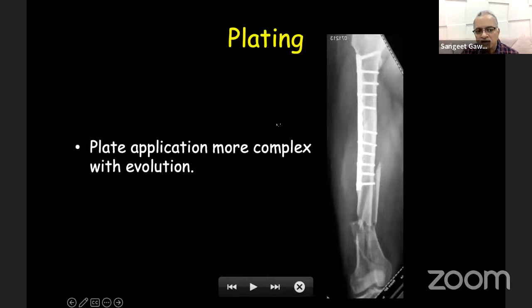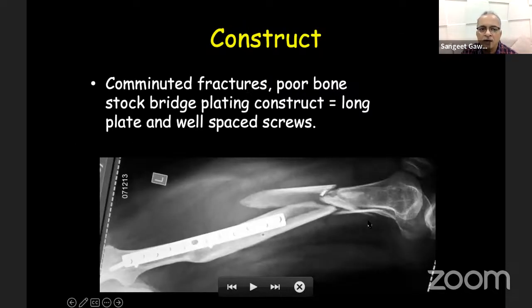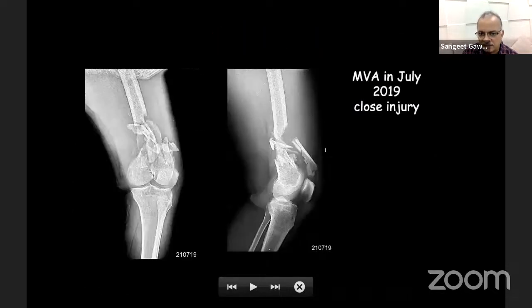Or if you have a complex fracture where there is an extensive comminution, there is an intra-articular extension, you have to mix the principle of neutralization. That is, some part of the fragments you fix with the interfrag screw, and then use the plate in a bridging mode, and you can end up having a good result like that.